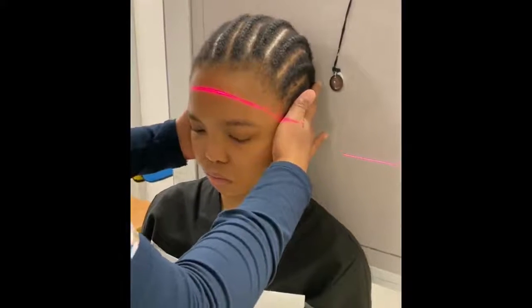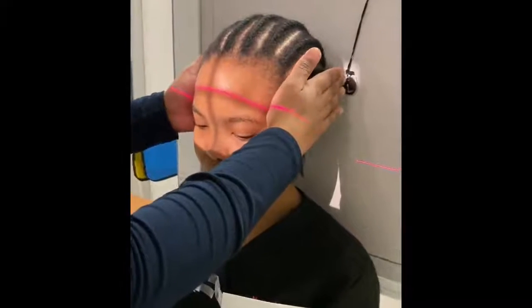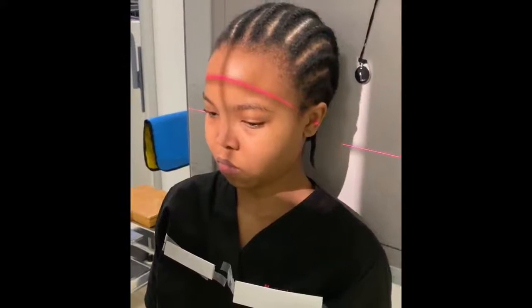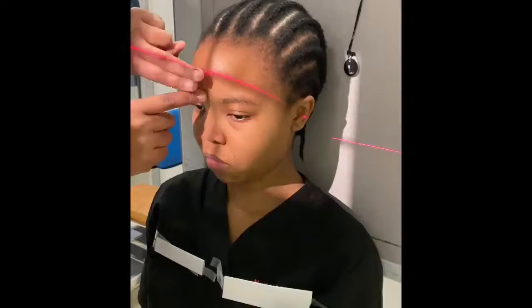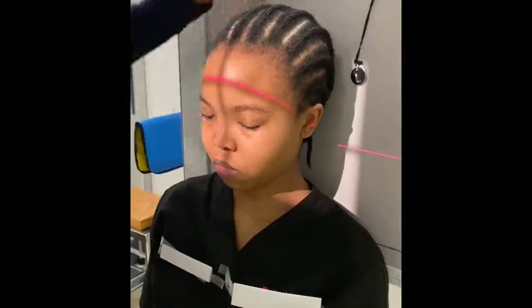So we can even tuck the patient's chin slightly more in. Then we need to make sure that our beam is directed in the mid-sagittal plane of the patient. There is no rotation or tilting, which we can adjust with the patient's head. We are centering in the mid-sagittal plane at a level about 2.5 centimeters above your glabella. So if we put our glabella around this area, it's about 2.5 centimeters superior to that. Remember that you need to collimate, and we put our marker readable on the side that we are demonstrating.